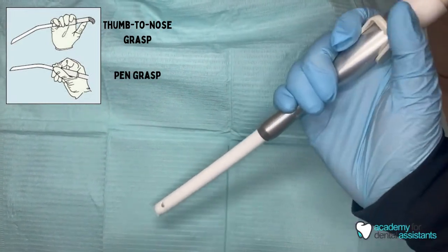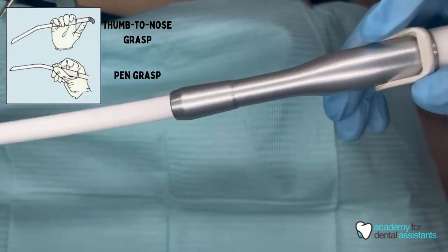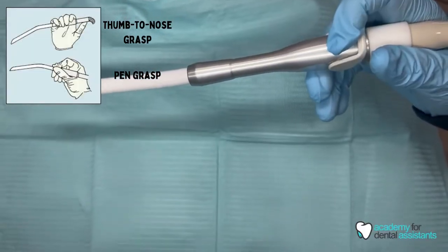You always want to make sure you have a finger towards the on and off switch so that in case of an emergency you can always turn it off right away.